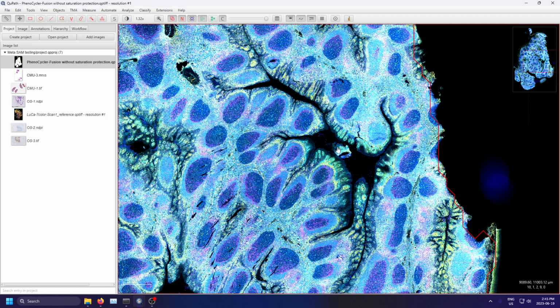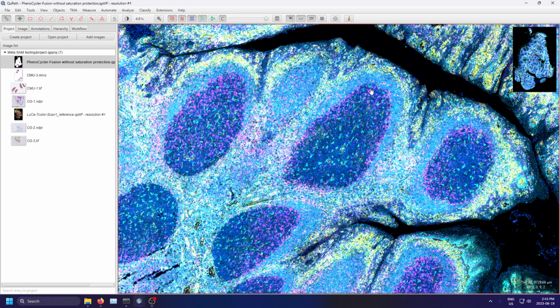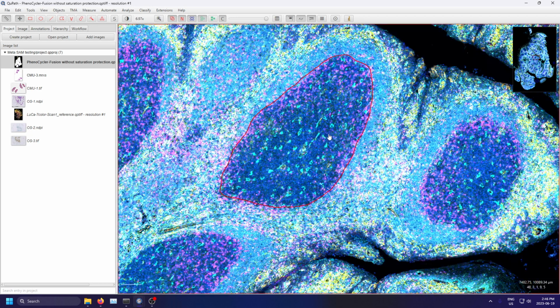That also dictates what structures end up getting segmented. So in this case, I have no idea what this round circular structure might be, but let's see what will happen if we pass it over to SAM. Yeah, it segmented the structure. Now, this could be of interest to someone studying whatever it is going on within this, perhaps immune cell activity in a particular region of the sample.